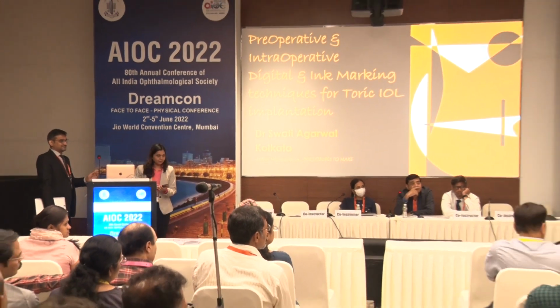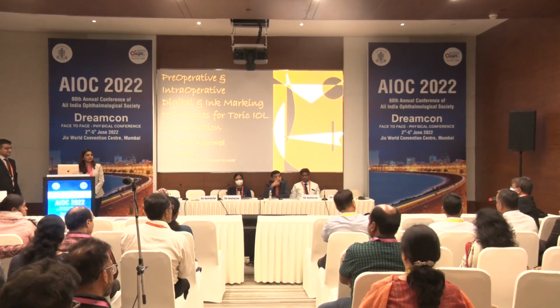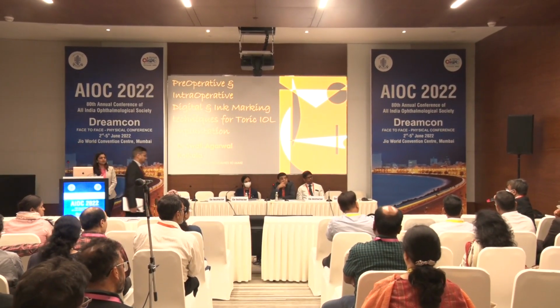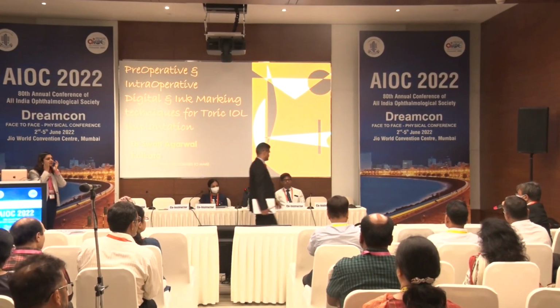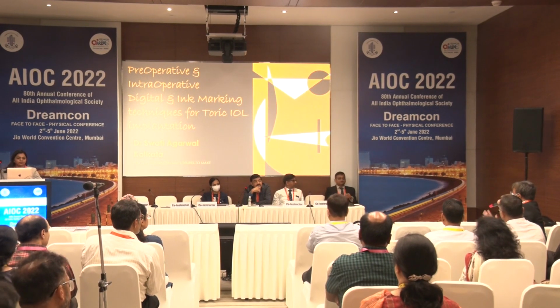Just a continuation of Dr. Roger Paul's question. Six to seven years back, Dr. Kevin Miller came to our place, and he implanted toric IOLs. I asked him what the result was. He told us 60%, 50% hit the bullseye, another 20% were within 0.75, and the rest beyond that. So you don't have to have all the instruments at one time to start a toric practice.